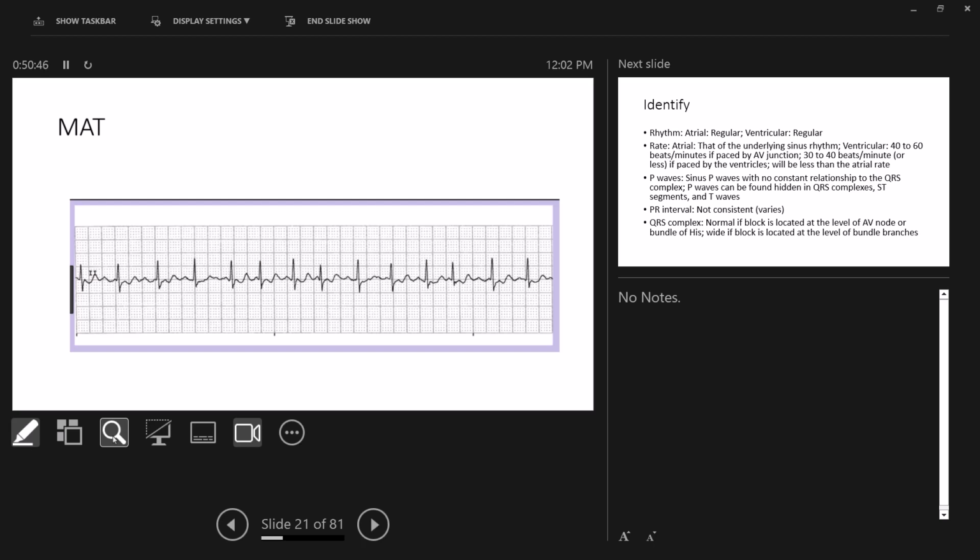Why does it look kind of like the humpback of a camel? No, not biphasic. This is another P wave that's embedding itself on the T wave. And again, what we would want to do is watch this patient for AFib to continue to develop. So again, AFib and MAT go really, really closely. AFib is usually going to be fast. MAT is always going to be fast.